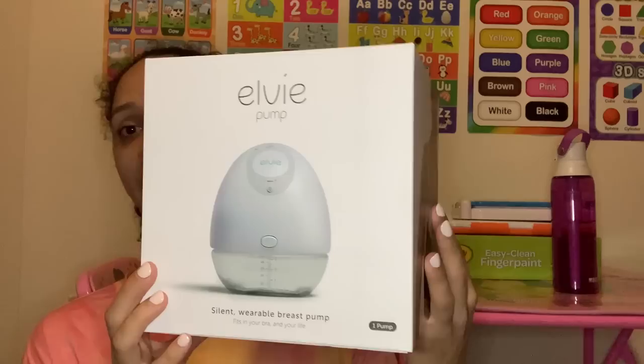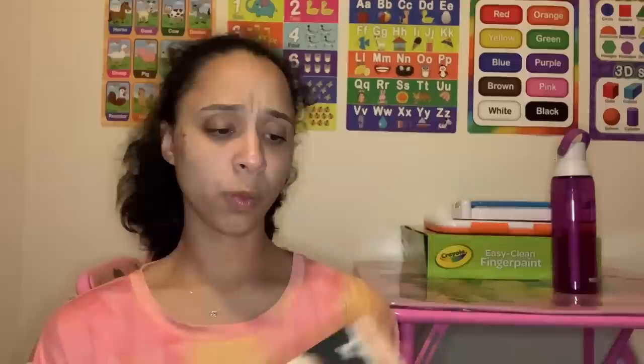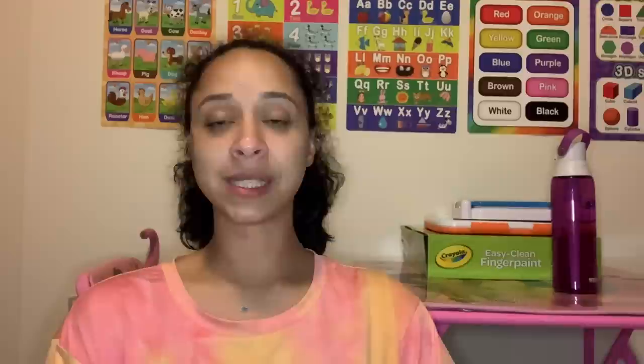I'm going to hurry this up because it's bath time then bedtime, but I wanted to do the unboxing before work tomorrow since I'm using it tomorrow. It comes nicely packaged like this. When I was doing my research, the LV just made a lot more sense — I didn't have to buy so many extra accessories. For the double pump, the LV comes with two chargers, whereas the Willow does not.